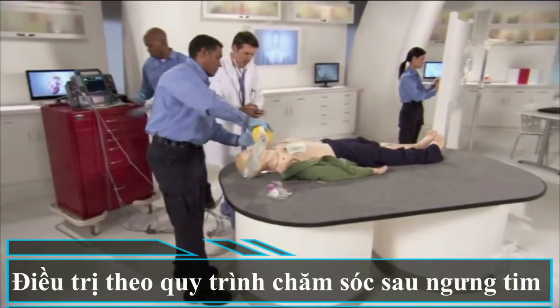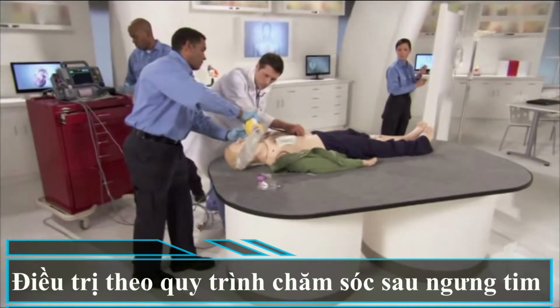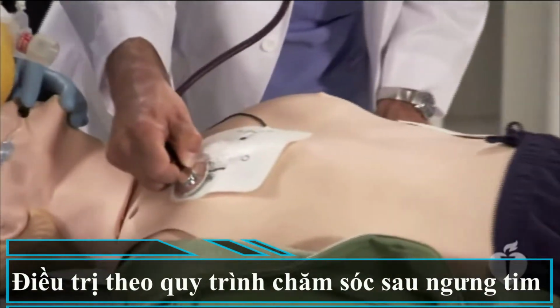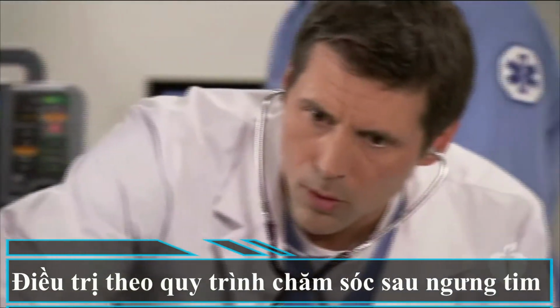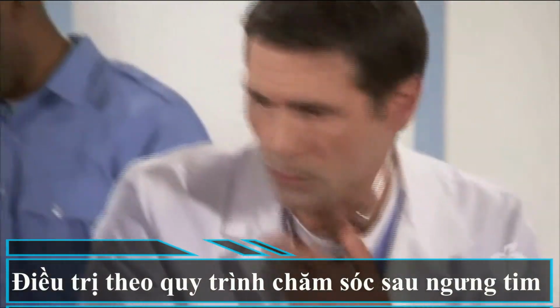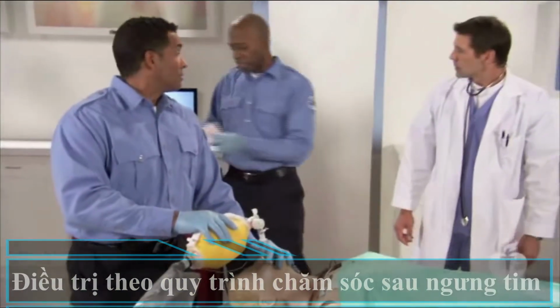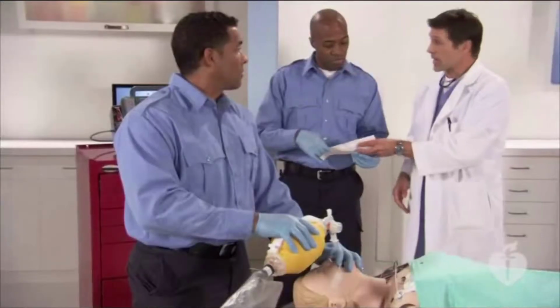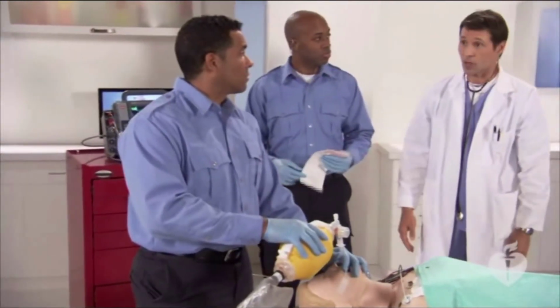Tube's in. Okay, we've got good breath sounds. Let's establish waveform capnography. The O2 saturation is 96%. Here's the 12 lead. Okay, she has a STEMI. Mandel, please call the cath lab and tell them that we have a STEMI patient. PCI and hypothermia can be safely combined after cardiac arrest.